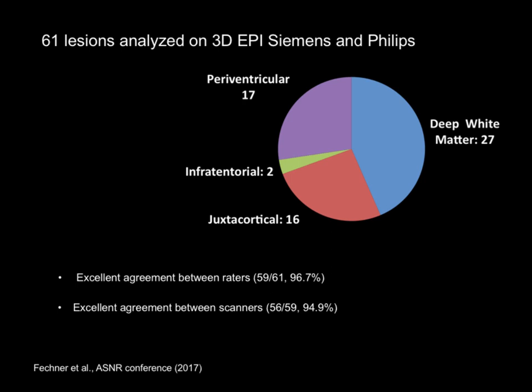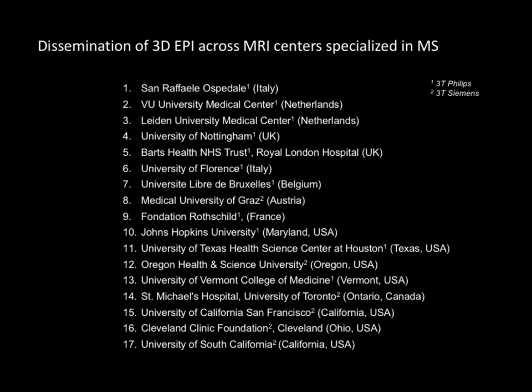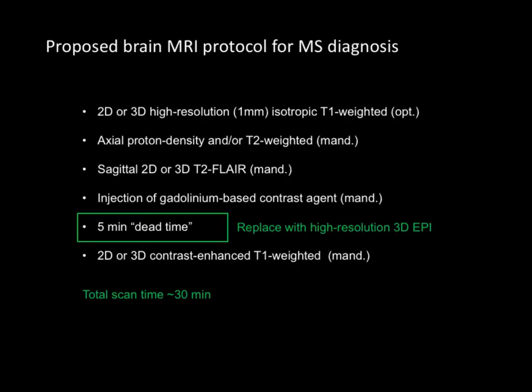So this is just putting that in numbers, but basically there is a very high reproducibility in detection across scanners. So for all these features, of course, we have encountered a great interest in the community, and already this protocol has been dispatched across more than 15 sites outside the NIH. And we're pushing this, hoping that clinicians will take it up and demonstrate that indeed in their clinic, they can actually replace that dead time with this sequence and get some important information about the diagnosis process.